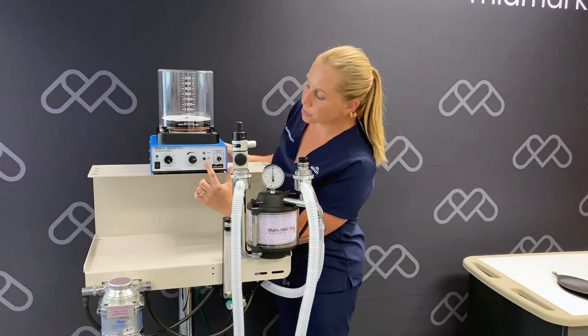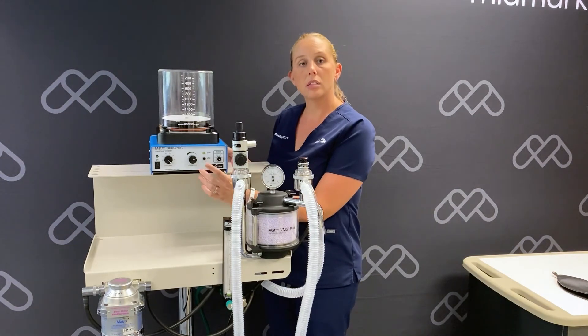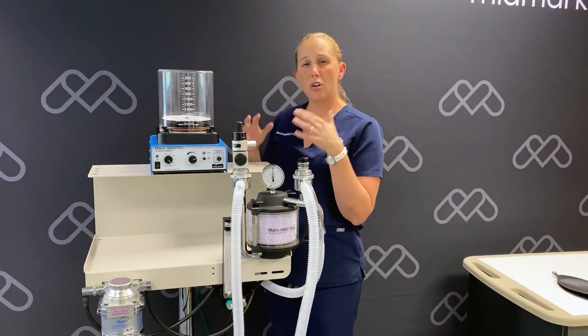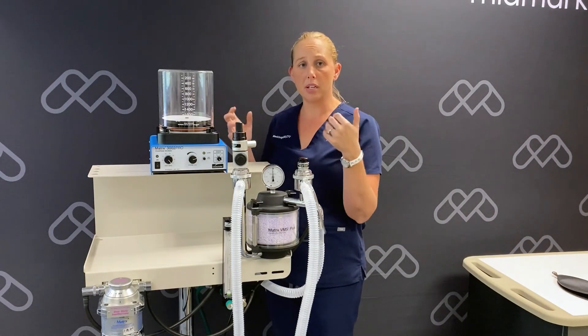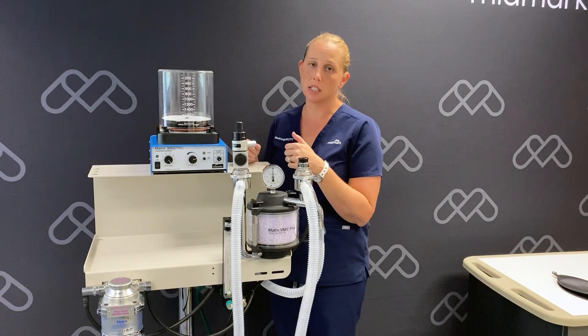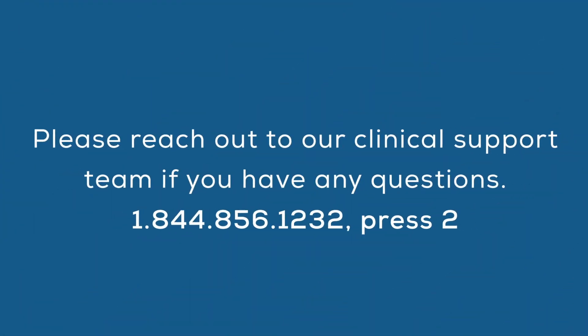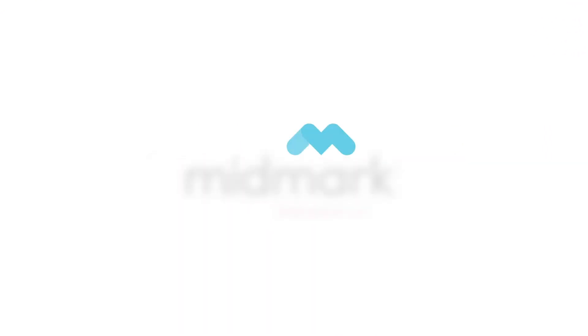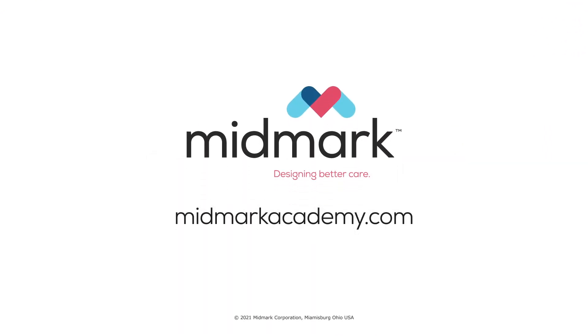And finally we have our inspiratory hold control. This is a push button that is used to pause the breathing cycle for as long as the button is held, unless the maximum working pressure limit is exceeded. Thank you so much for joining us.